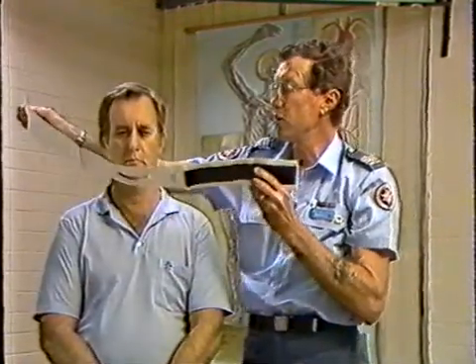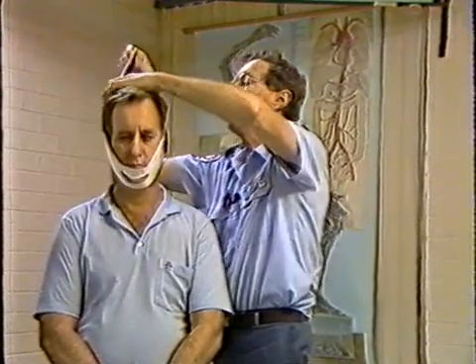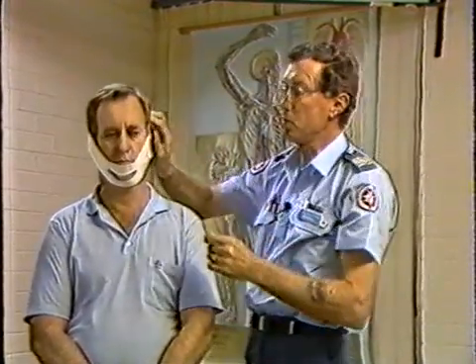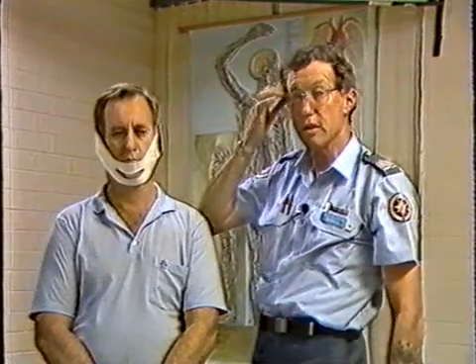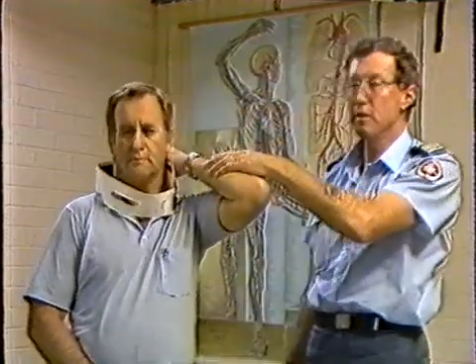You can also advise the patient themselves, once it's applied, because it is not on very firm, you can say to the patient, if you feel like removing it and you wish to vomit or you wish to clear your airway, you can just get your hand and pull the back of it down, and it will drop off.